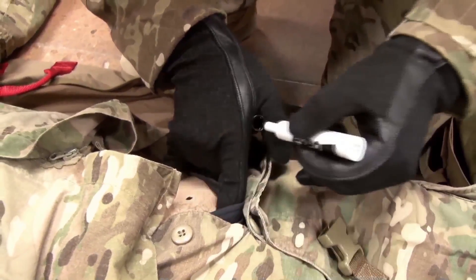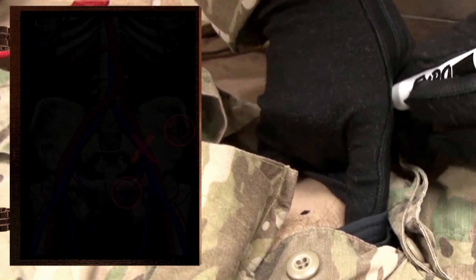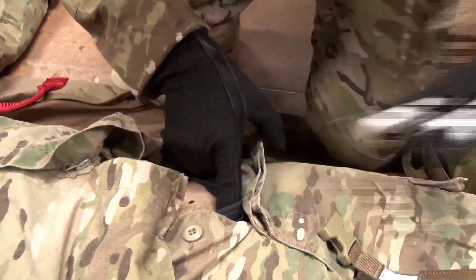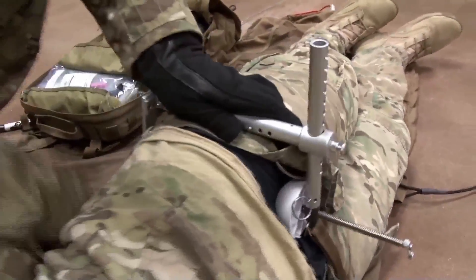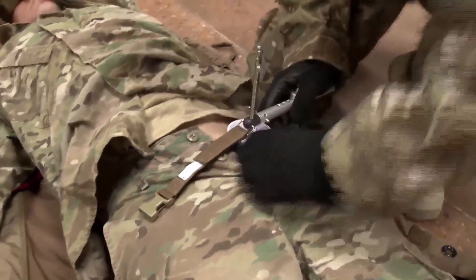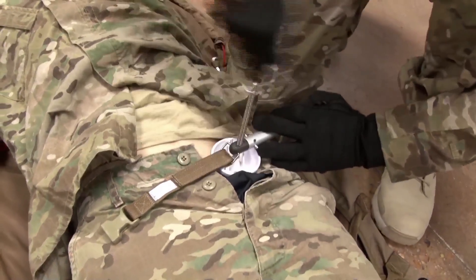Find the midpoint and mark it. Position the Croc base plate under the patient beneath the desired pressure point. Ensure the vertical arm is in contact with the patient on the wounded side in close proximity to the wound location. Adjust the horizontal arm to position the pressure disc over the pressure point.